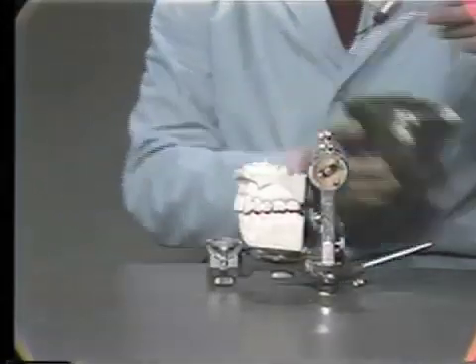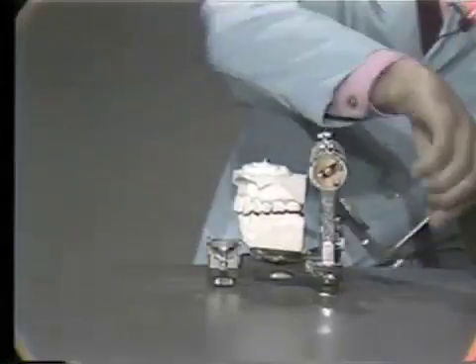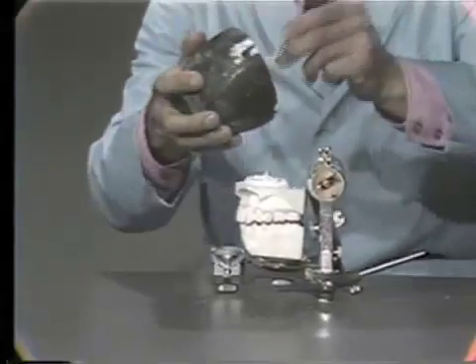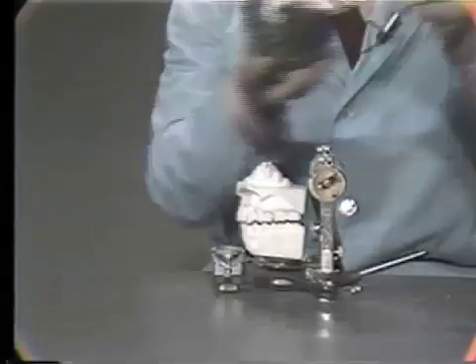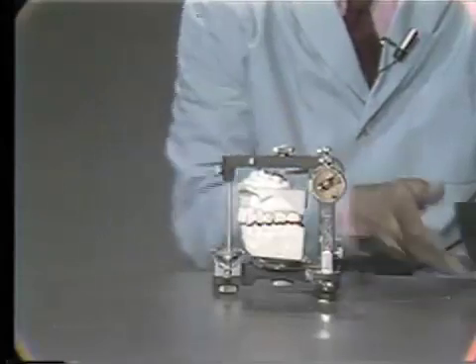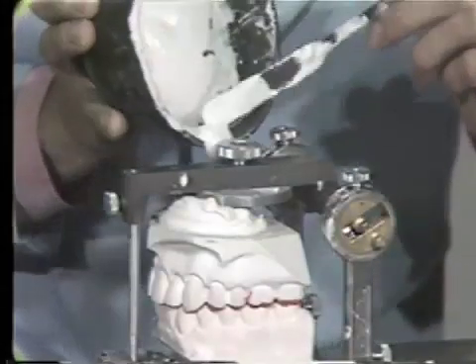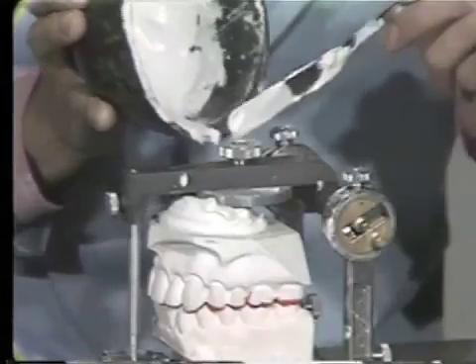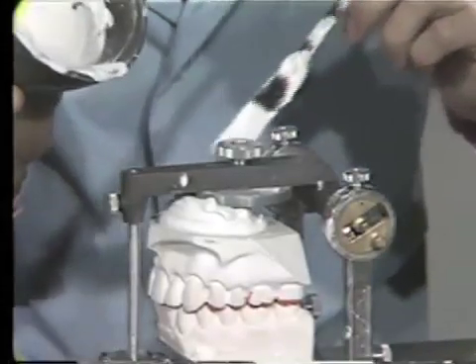As usual, this stuff comes out wrong and short. Then I'm going to load the rest of this stuff into the articulator ring undercut.